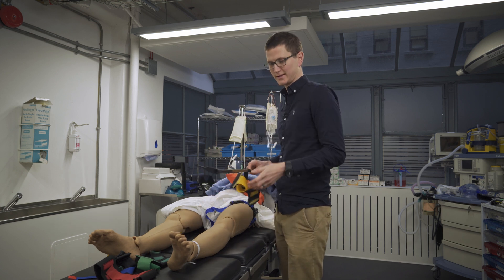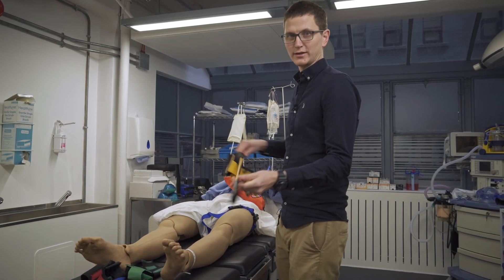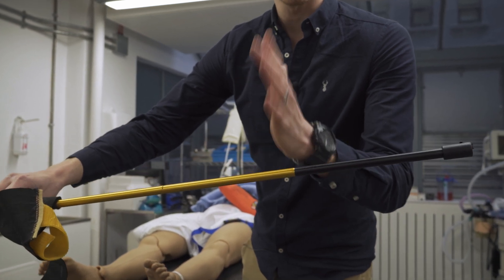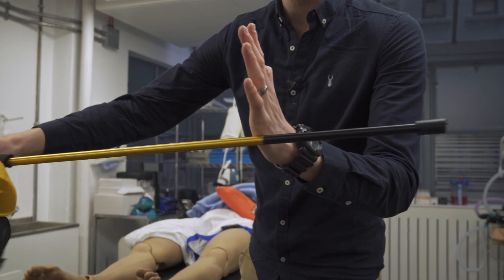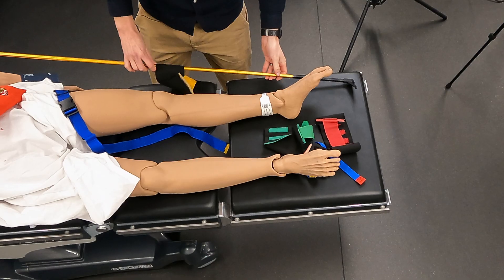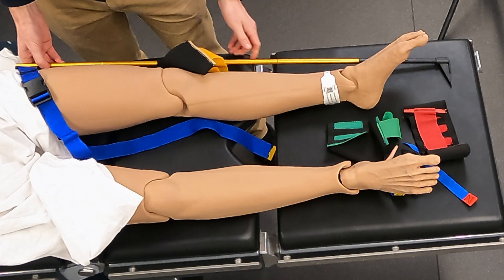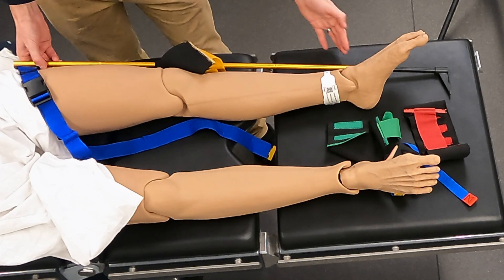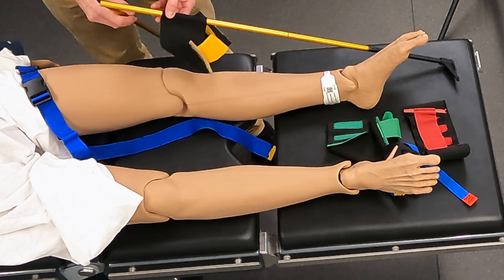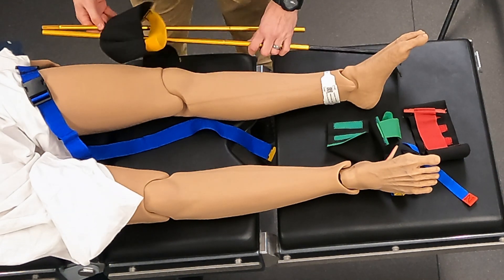While they're holding manual traction, the splint is then applied. Coming back to the biggest point of failure: this black line — you can see it's different colors — the black line should be at the foot or past the foot. It needs to be distal to the foot, so after the foot. When measuring, if the black point is not past the foot, the poles are too small. Go to the second pole, because often someone will pull traction and there isn't enough space. The black point needs to be past the foot.